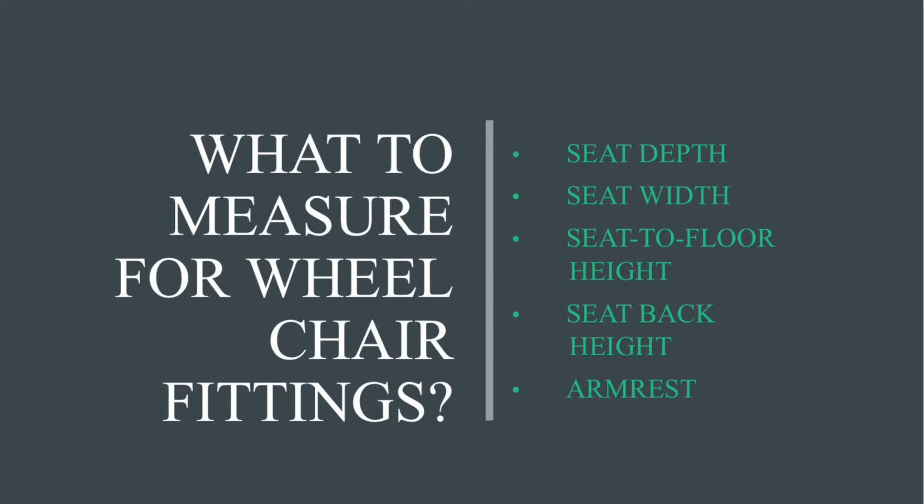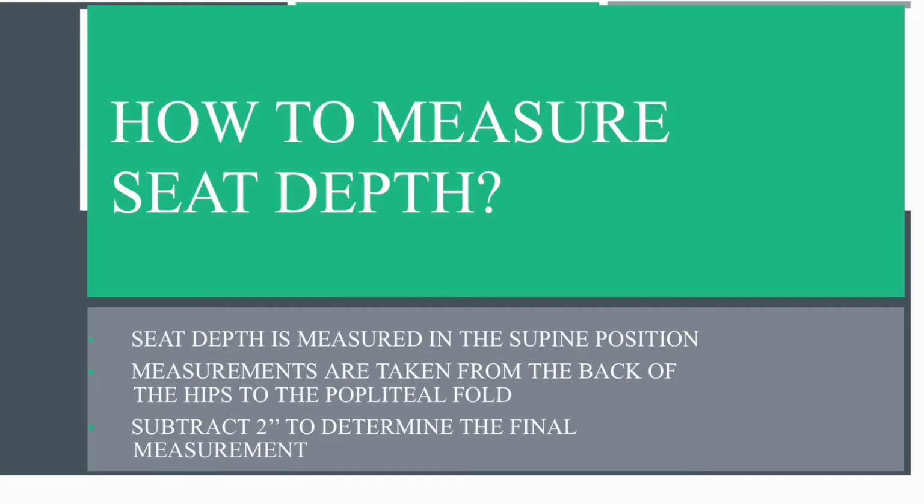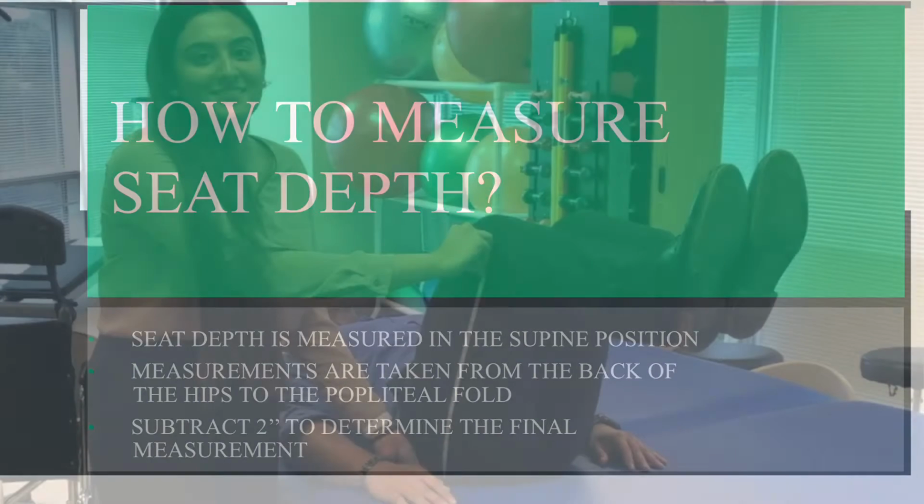What to measure for wheelchair fittings: seat depth, seat width, seat to floor height, seat back height, and armrest. Seat depth. Seat depth is measured in the supine position. It is the only wheelchair fitting measurement that is done in the supine position. Measurements are taken from the back of the hips to the popliteal fold. Once a measurement is taken, subtract 2 inches to determine the final measurement.